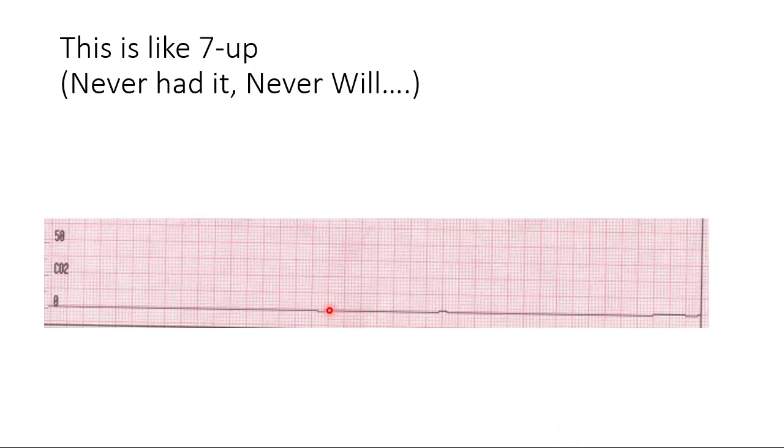These little blips, these are nothing important. These are so close to baseline, they're inconsequential. You cannot assume that this is a viable end-tidal CO2 reading. This might be a little leakage from the respiratory tract into the gut, whatever the case may be. You should have a clearly identifiable plateau that associates with your respiratory rate and whatever you're doing for the patient's ventilation.